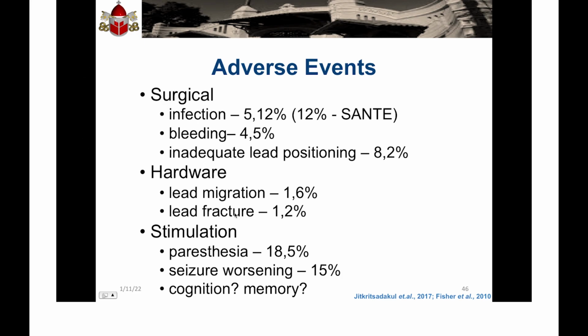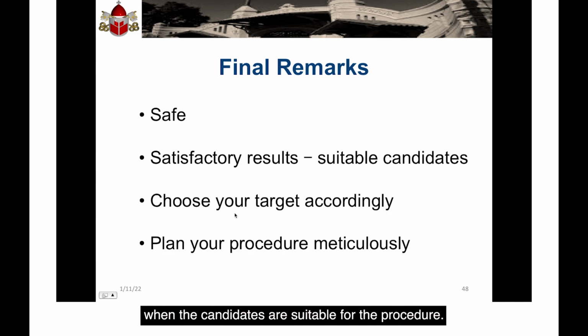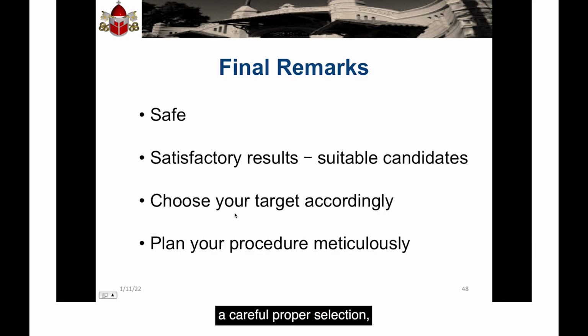And what are our final remarks? DBS is a safe procedure for patients with refractory epilepsy, and it has satisfactory results when the candidates are suitable for the procedure. So as we mentioned previously, a careful selection of patients and a careful target selection are essential for a good outcome, as well as meticulous planning of the procedure.